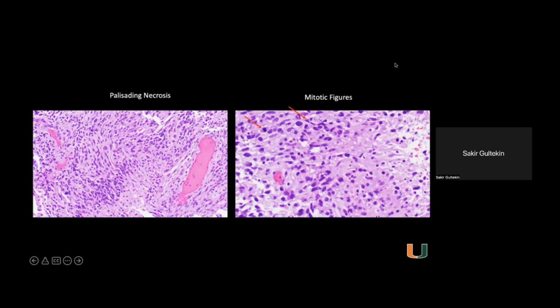diagnosis, we have a glioma, and this is sort of an amorphous proliferation of glial cells with a good example of palisading necrosis in the center bottom of the left slide, with the center necrotic and the perinecrotic areas having a higher density of tumor cells. That's why it's called palisading necrosis, to repeat myself. And there are mitoses on the right side with the red arrows. I indicate 2 of them. 1, and the 2 is a little bit more difficult to see.